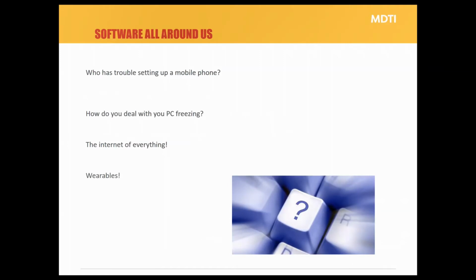So we've got software all around us. We've got mobile phones that are getting increasingly complex and have a lot of content on them. And I increasingly see content coming into mobile phones of a medical nature to monitor, alleviate, and even in some cases purport to prescribe. Interestingly, there were some articles circulating on the internet in the last few weeks that Apple have actually said that they won't take medical device applications into the Apple Store anymore unless it's been demonstrated that they've gone through adequate regulatory scrutiny. So there's an increased focus on this area and a need to be doing it properly if you're going to be successful.